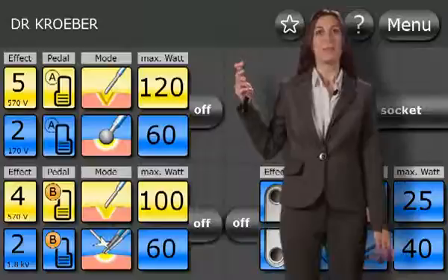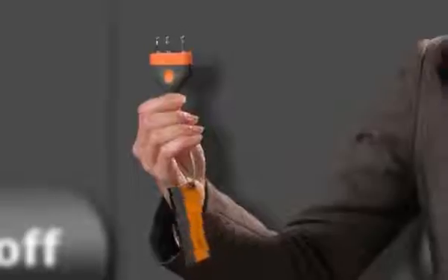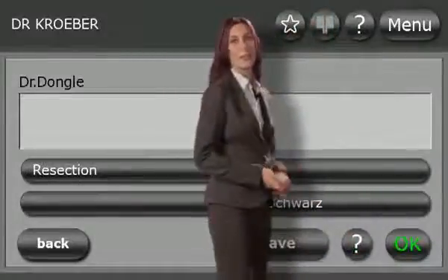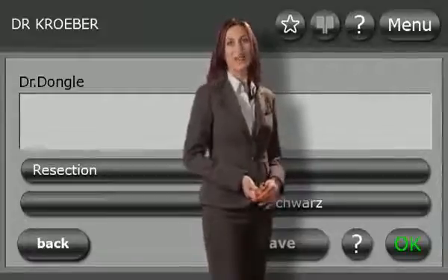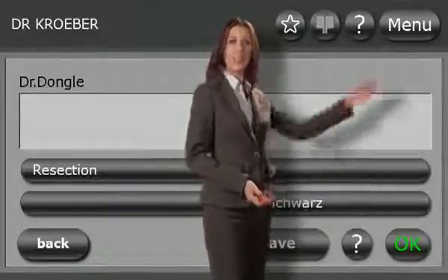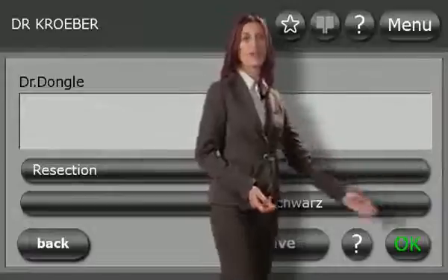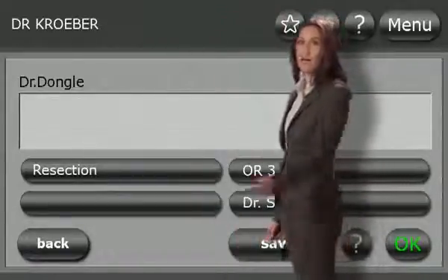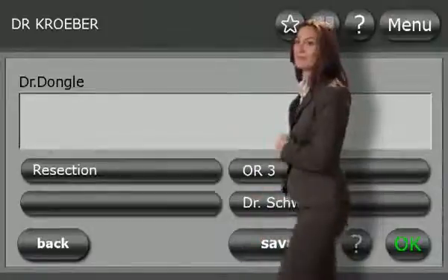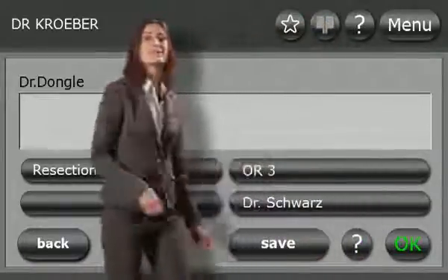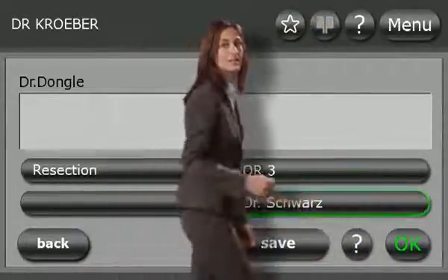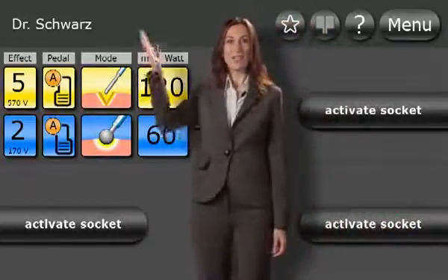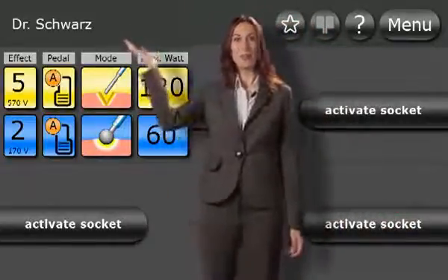This is Dr Dongle. He always ensures that you have the right settings in your pocket. Plug your own personal Dr Dongle with your own personal settings for any ARC 400 into a bipolar socket, and select the appropriate program from your own personal store. The selected program name appears in the top menu bar.